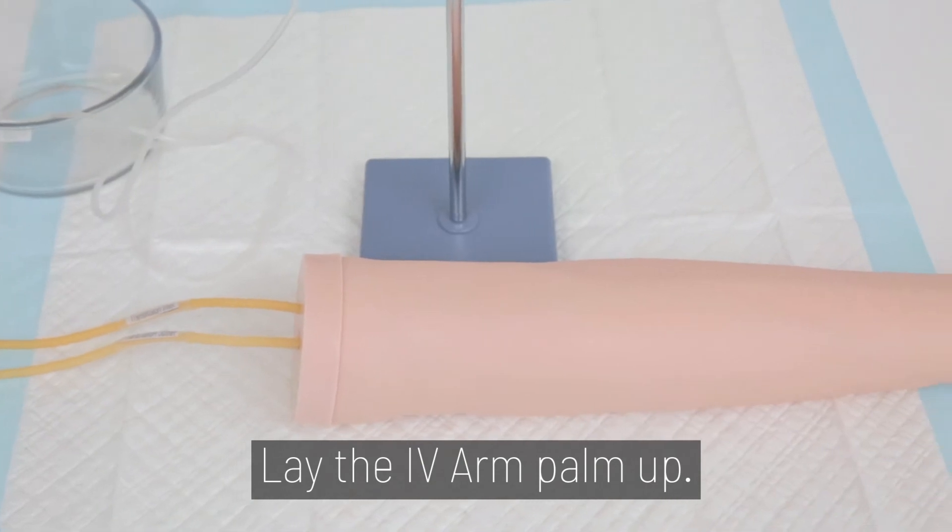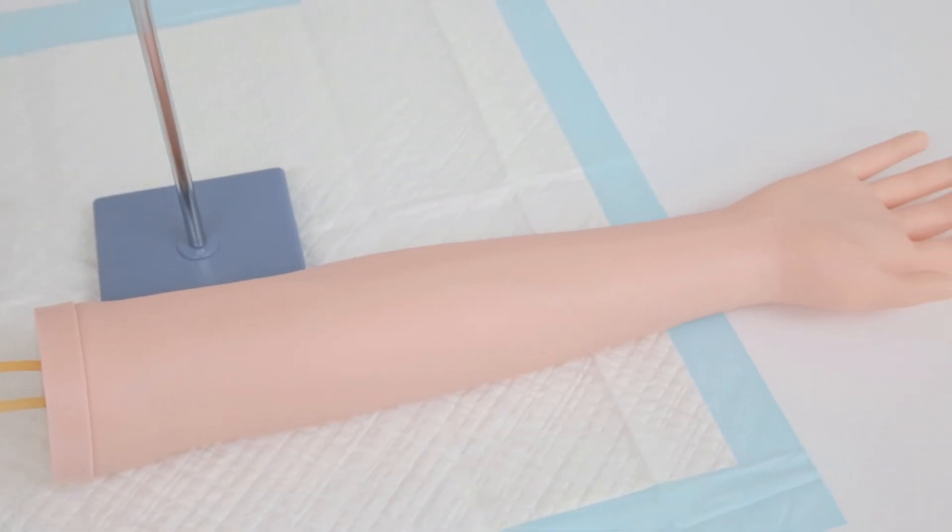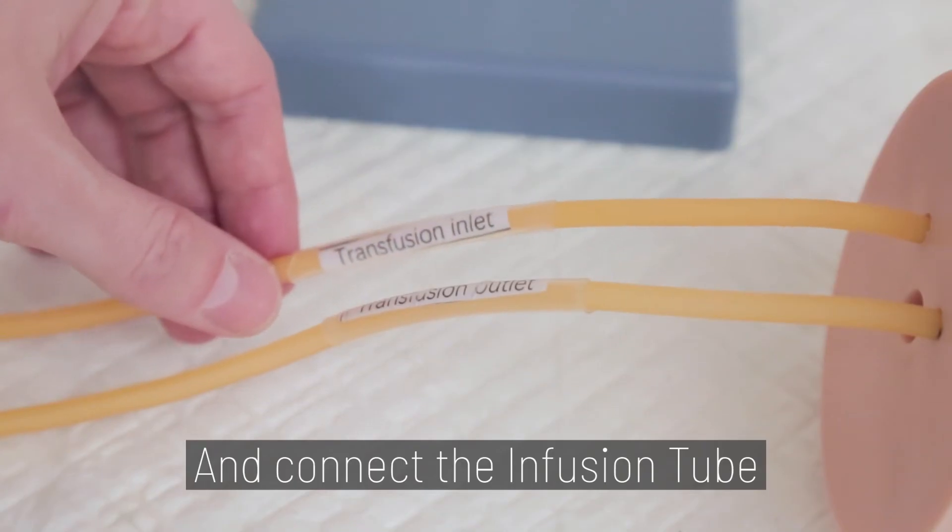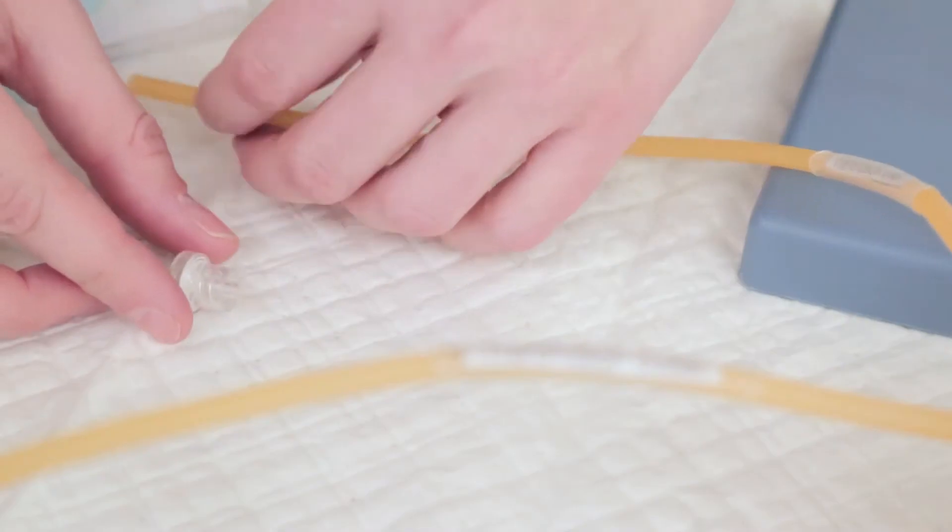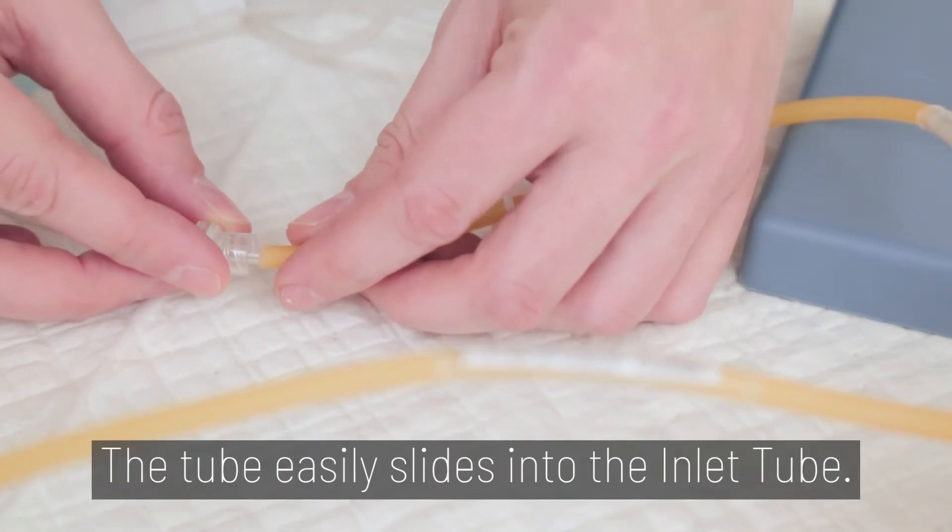Step 4. Lay the IV arm palm up and connect the infusion tube to the transfusion inlet tube. The tube easily slides into the inlet tube.